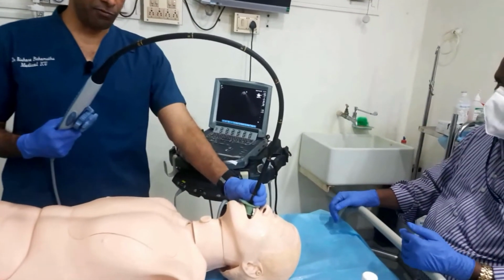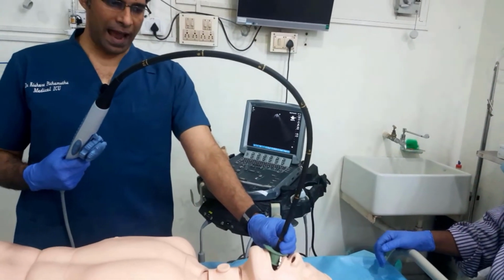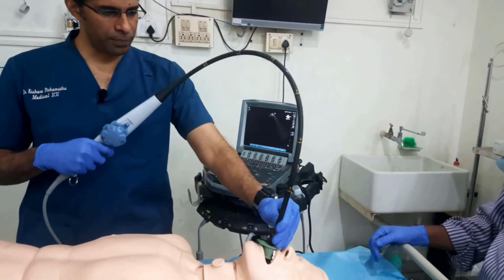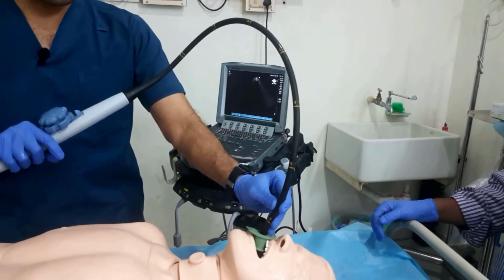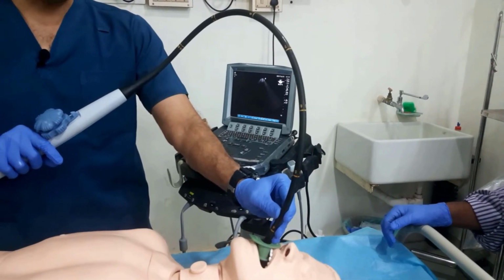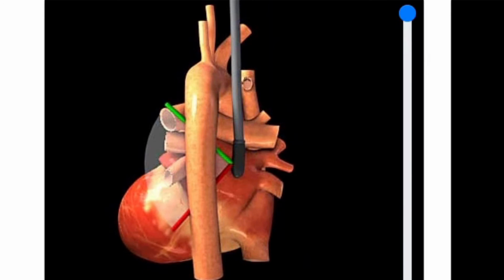The next view after the bicaval view is a view that looks at the aorta in long axis. So from this position of the bicaval view, I then rotate the probe to the left, as you can see here. So once I've rotated the probe to the left, you will now be able to see the descending aorta in long axis. In the mid-esophageal descending aortic long axis view, we've rotated the probe to the left, and so you can see that it's slicing through the descending aorta, and because it's 90 degrees, you're going to get a long axis view. And this is what it looks like.